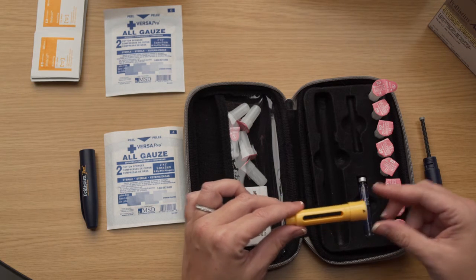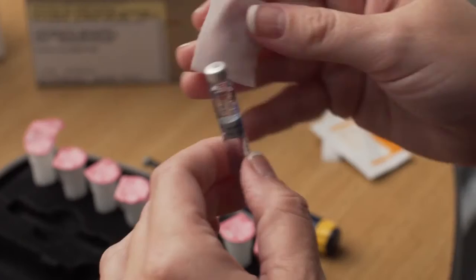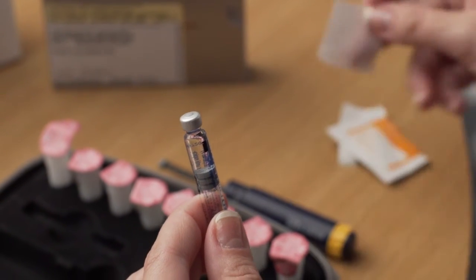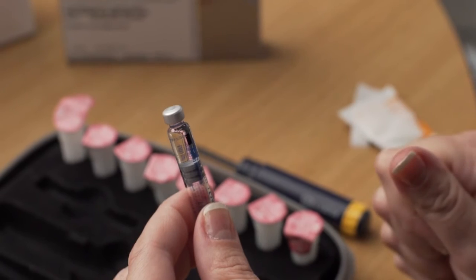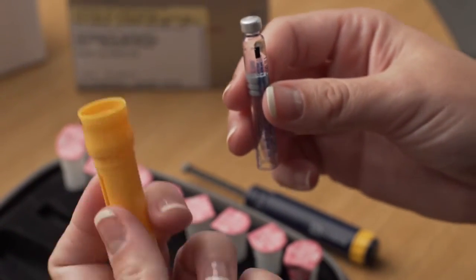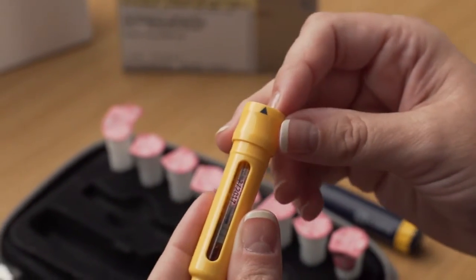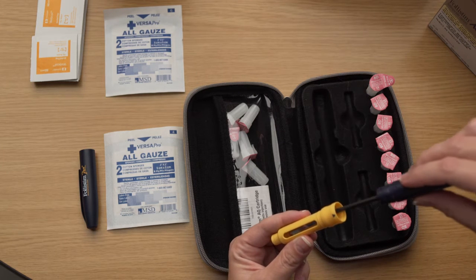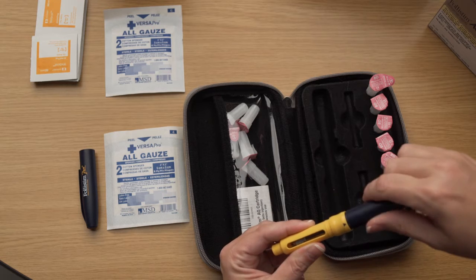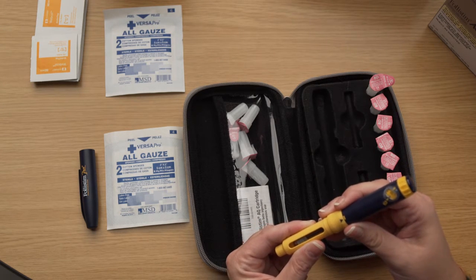Unscrew the entire blue section from the yellow section and set them aside. Now unpack a Follistim AQ cartridge. The liquid should appear clear and free of particles. Before inserting into the pen, clean the rubber stopper on the cartridge with an alcohol wipe. Pick up the yellow section of the pen and place the cartridge inside by inserting the metal rimmed cap in first. Now pick up the blue section of the pen and lower it into the yellow section. The black rod must press against the cartridge. Screw the blue and yellow sections together.